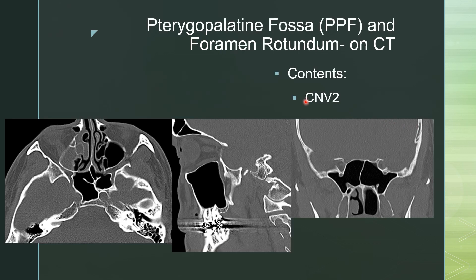The pterygopalatine fossa, or PPF, and foramen rotundum. On CT, you're looking at that retromaxillary space — this canal dorsal to the maxillary sinus. It contains mostly fat, as you can see on imaging, but the contents are cranial nerve V2. Here it is on the sagittal; you can see the PPF, the pterygopalatine fossa. Then here is foramen rotundum.